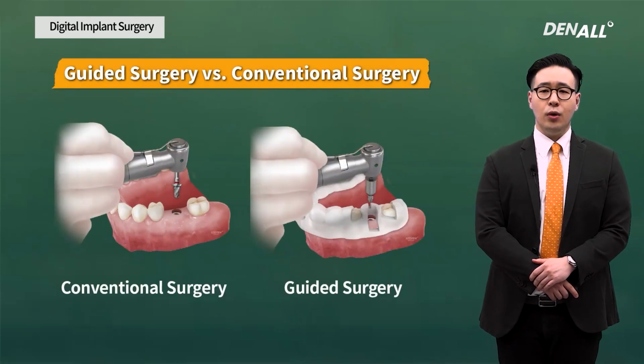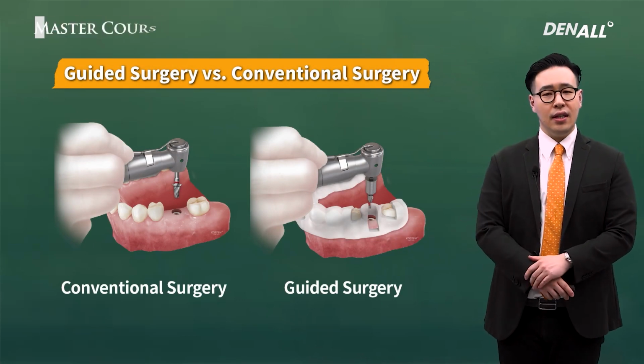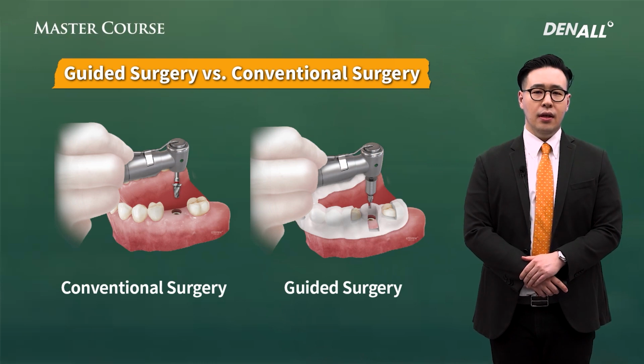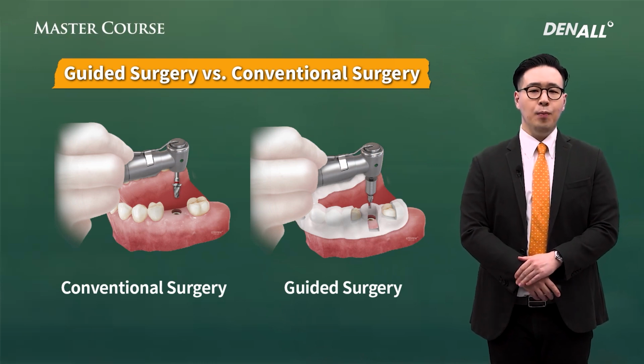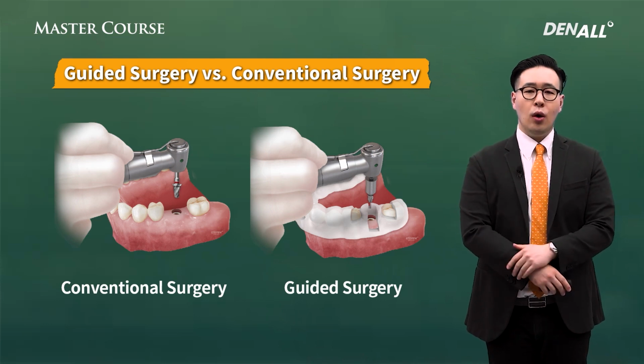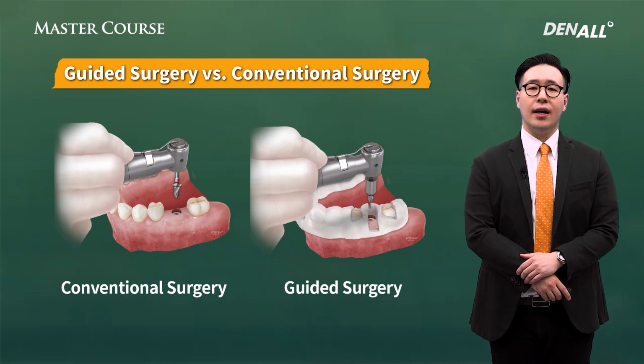If you use the guided template as in the right, you need to have an appropriate drilling kit for the guide. This special drill barrel comes in contact with the guided template as it enters into bone or expands the drill hole in the planned position without errors.